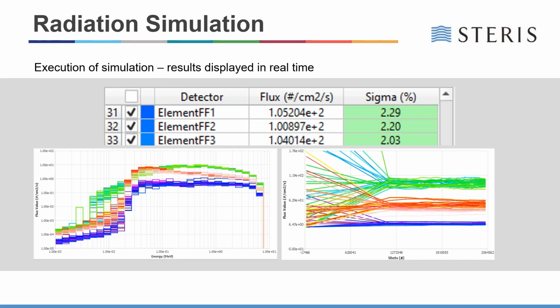These representations help begin to visualize how the results are being collected as a function of time and quickly identify if the time is what is being expected.